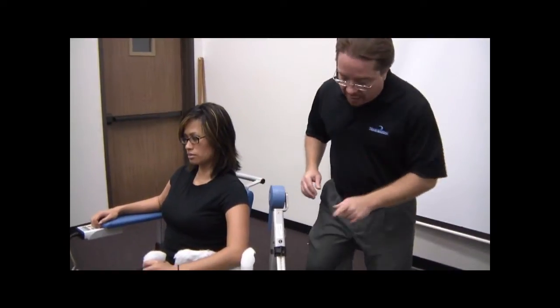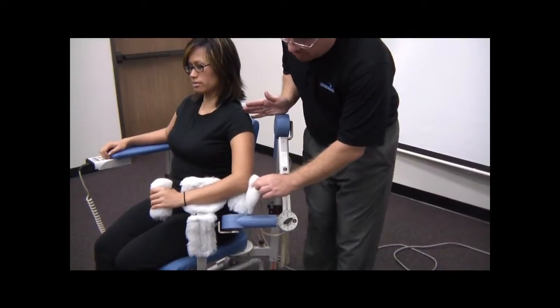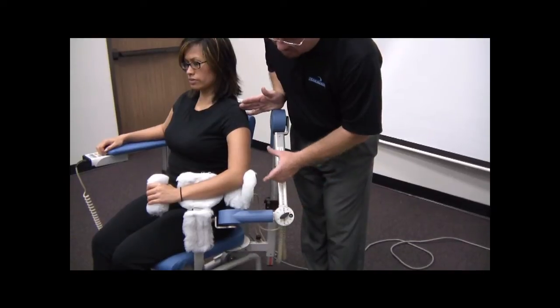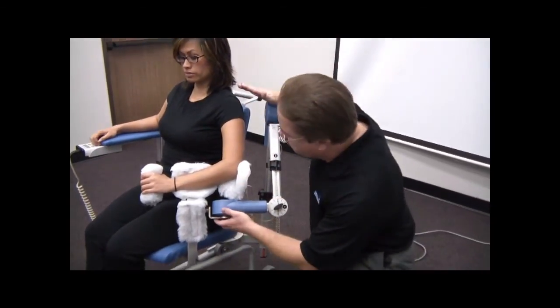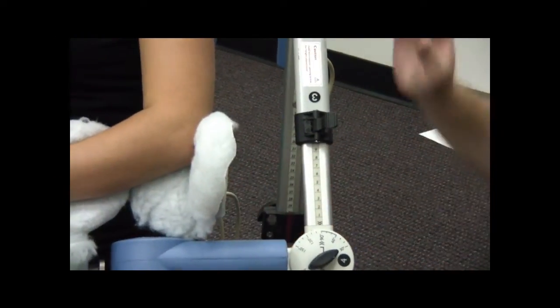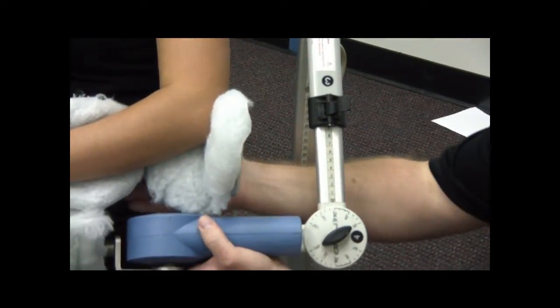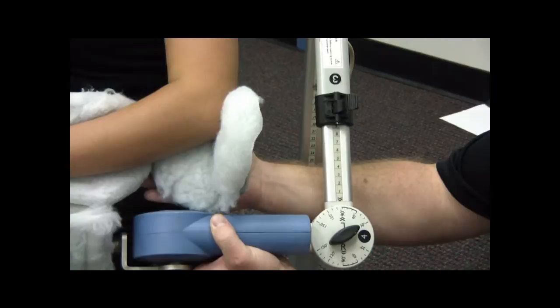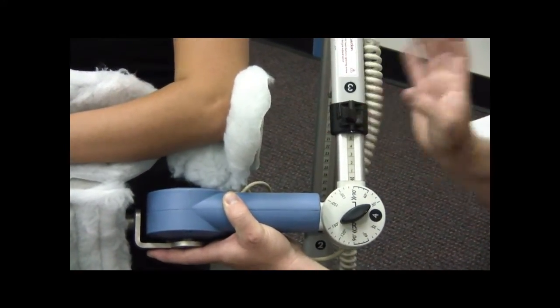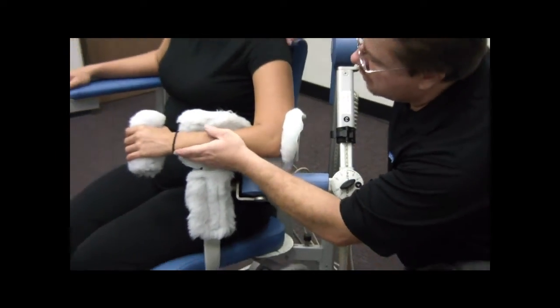Now our number 3 setting is the length from the pivot point on the shoulder to the elbow. And you can see here for Ann, that is way too short. She has short arms, so this right now is much too long for her. So what we're gonna do is we're gonna flip this lever for number 3. Now when you go to make this adjustment, if you just try to pull or push, you're gonna jerk the arm. You have to release the weight of the motor by lifting here, and then we can gently move that in, and then we'd lock it back in, and then we'd have Ann position her arm properly in the orthosis, okay?